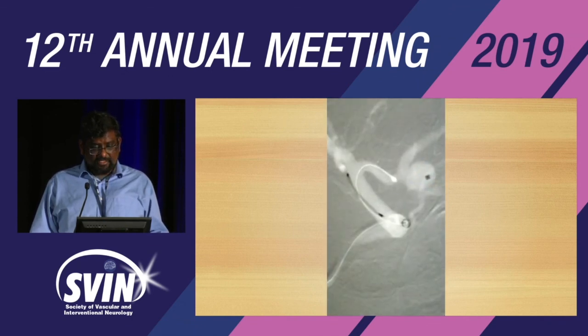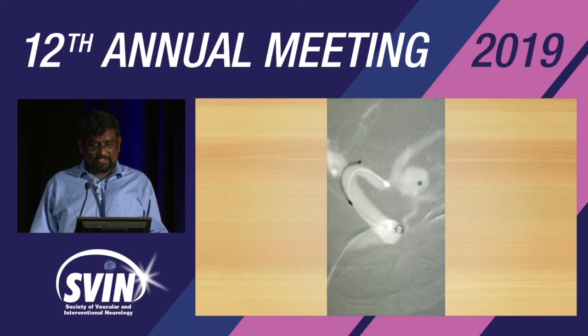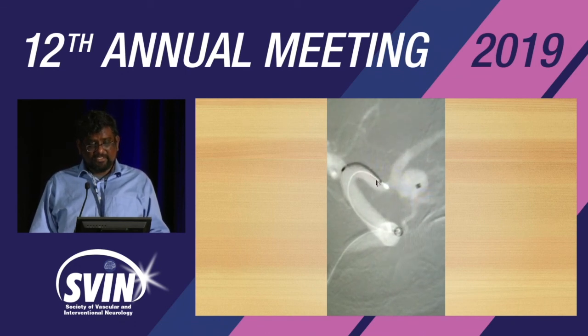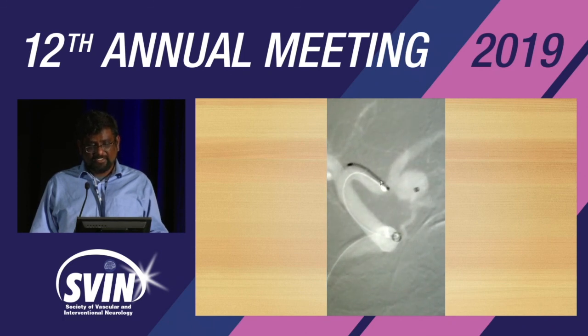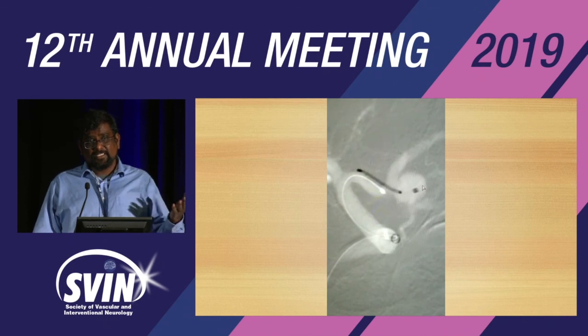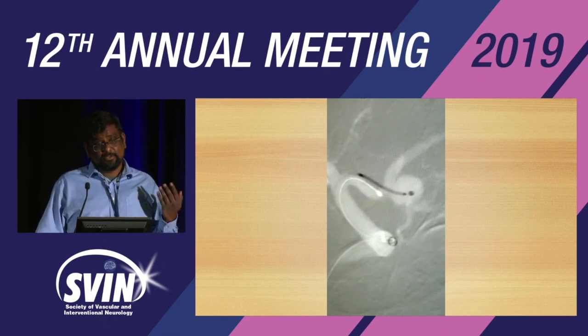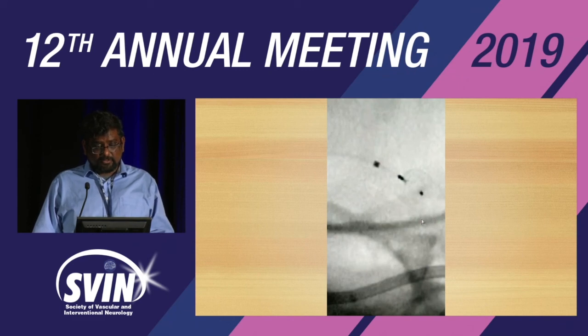So here's another ACOM. Similarly, it's advancing the device. You can see it's not at the dome, not at the neck, it's somewhere in between. But here you see this previous roadmap shows it beautifully. This was the contour of the microcatheter. Now look what the contour of the microcatheter is like. So it can really straighten out your system. If you have your microcatheter near the aneurysm dome, it can go right through the dome as you straighten it out. The other thing that can happen is if you have it too close to the neck, it can come out. So you really need to go very slow around the bends, and you need to take your time doing multiple roadmaps.